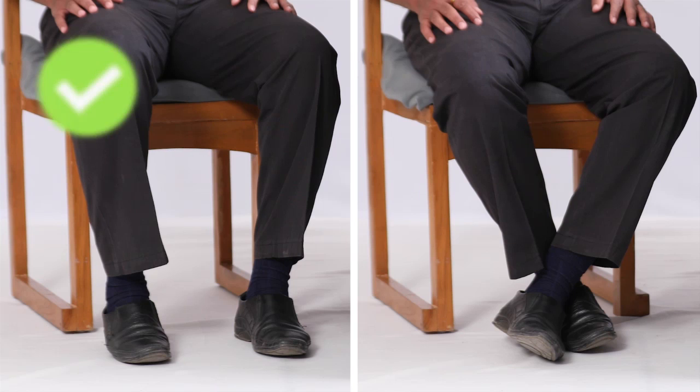Sit upright with your back supported. Make sure your legs are grounded and not crossed. Do not speak or move while the machine measures your blood pressure.